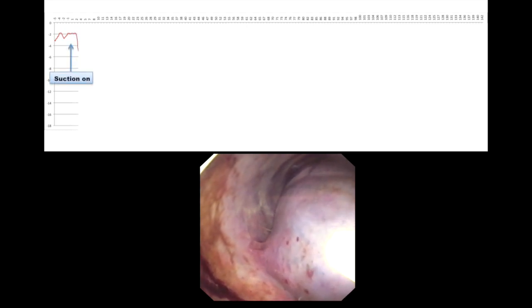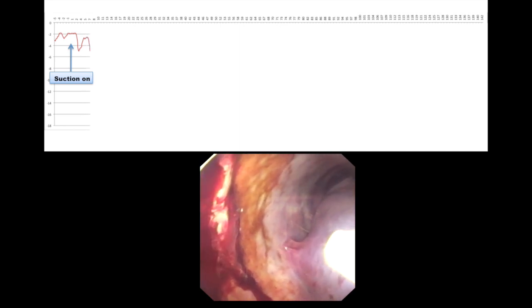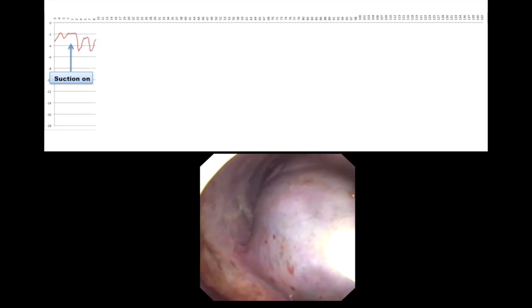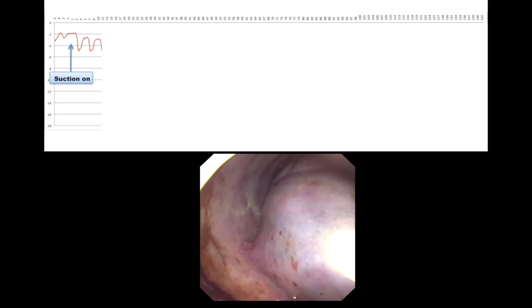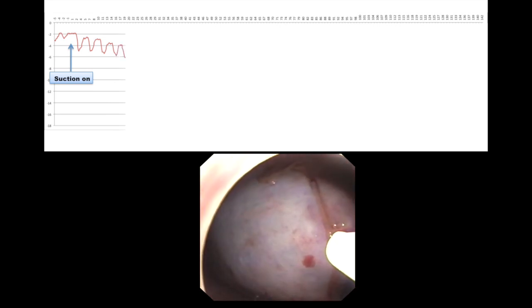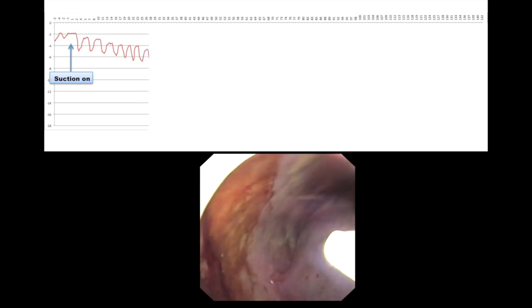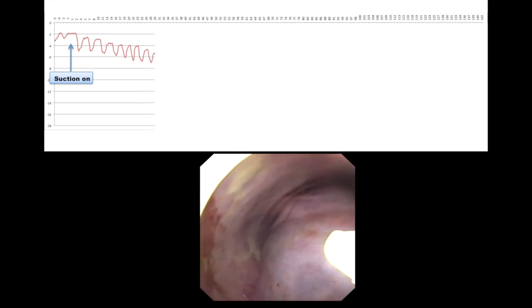In this video, we have explored the possibility of measuring intrapleural pressure in real time during simulation of lung expansion. The pressure transducer is attached to a 1.8 mm catheter and introduced into the pleural space via the working channel of the semi-rigid pleuroscope.